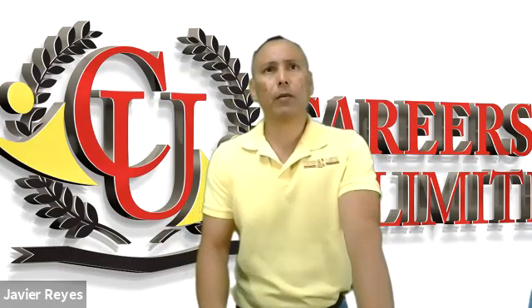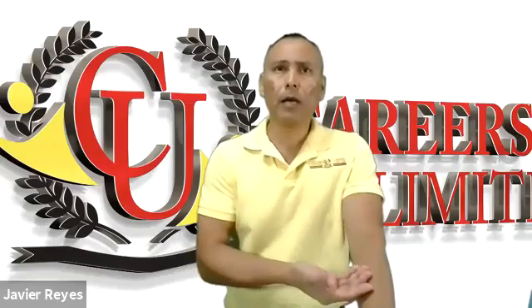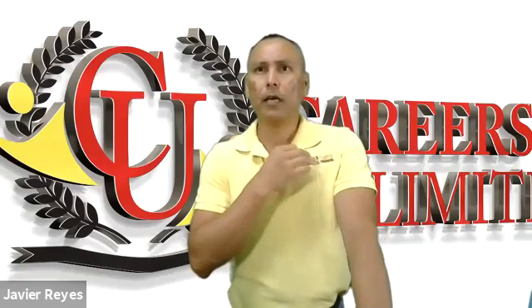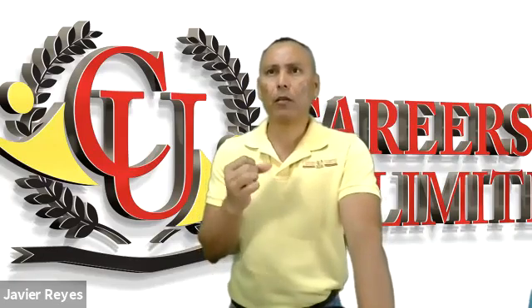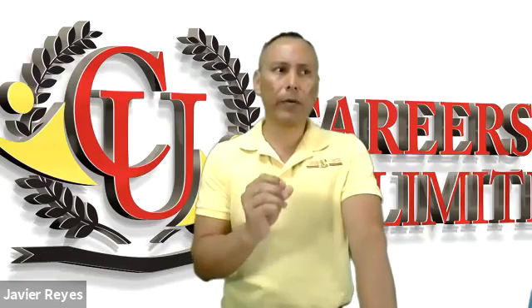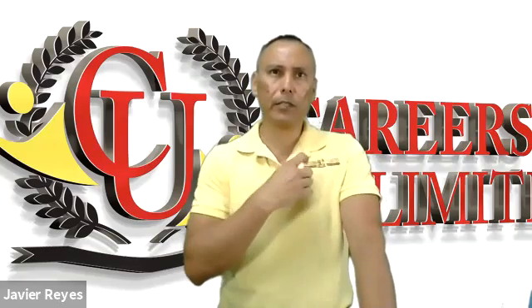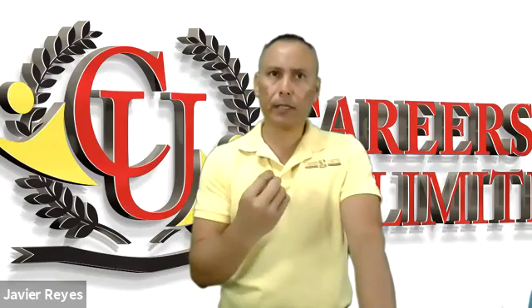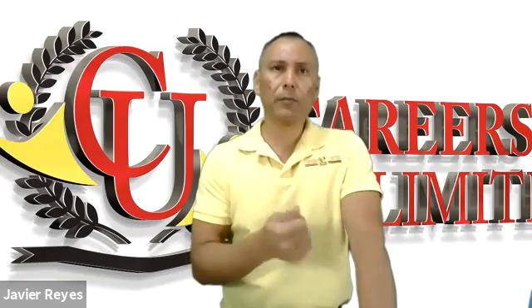Instead of the patient having a risk of getting an infiltration with chemotherapy, which may damage the arm, they place these very small devices. So you only see a very small circle about the size of a quarter. Now, these devices are accessed using a Huber needle. It's a 90-degree needle that is inserted into the catheter, and then we connect a small tubing connection so that we can infuse medications.